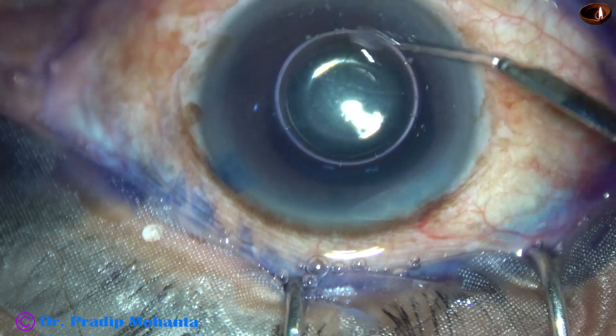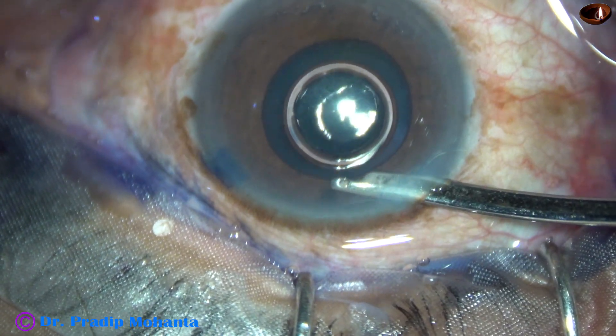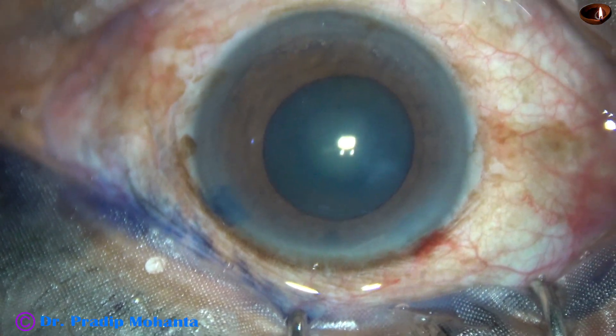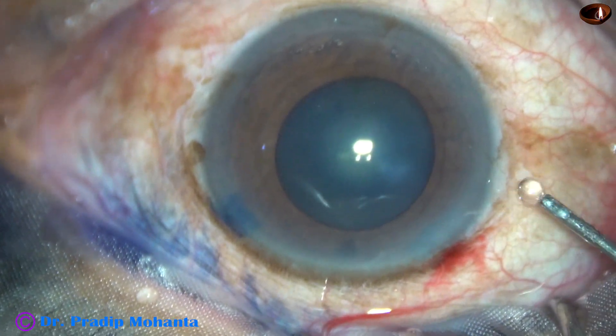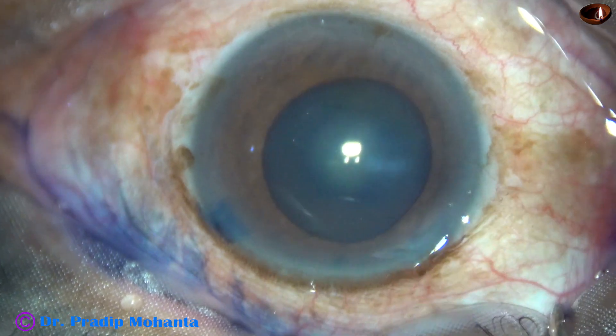Yes, it has dilated to some extent, maybe 4.5 mm or so. And as I inject viscoelastic, the size of the pupil will increase a little more. This is 2% hydroxypropylmethylcellulose.